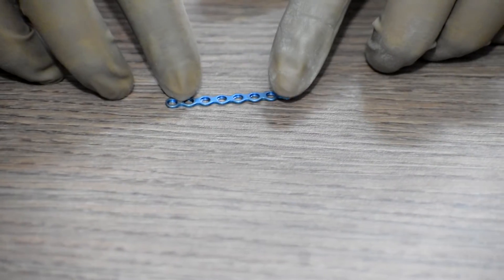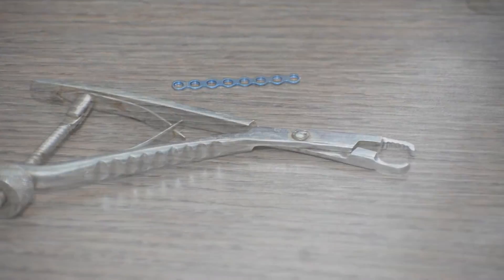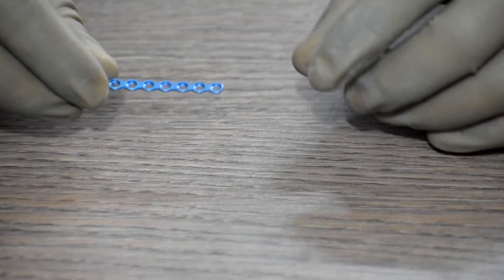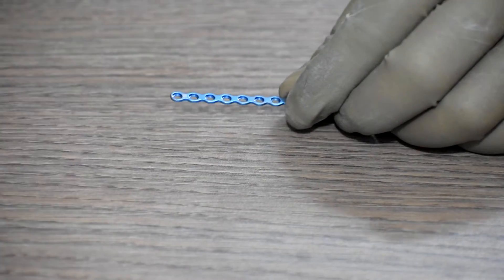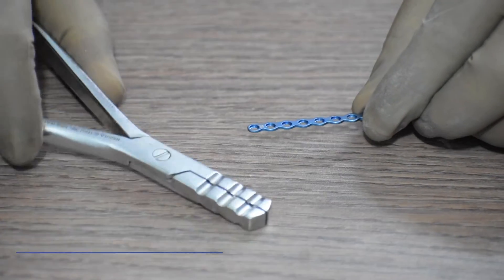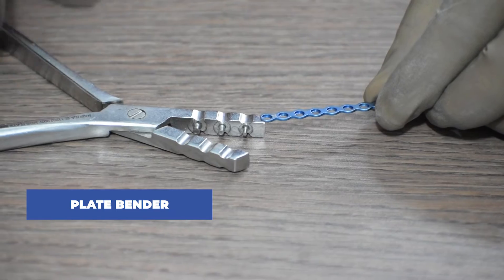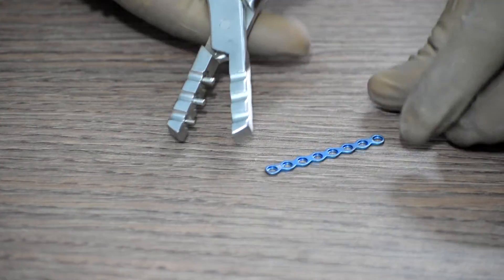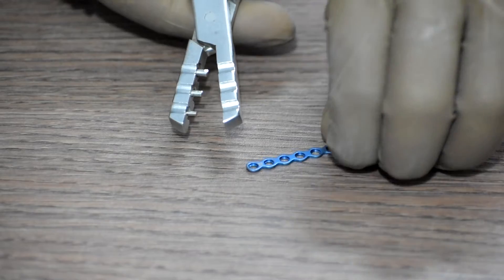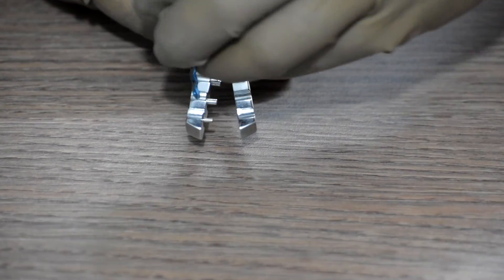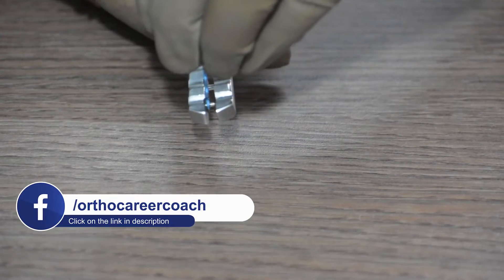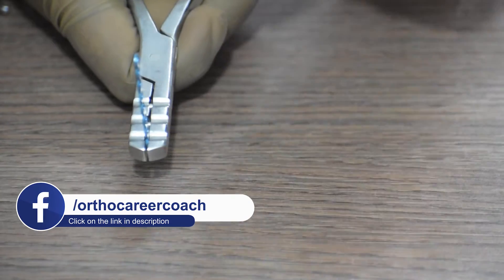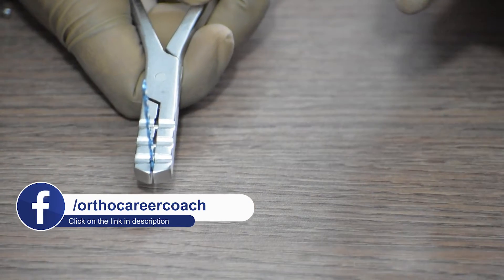First, we will have to hold the mini straight plate in the fracture site using plate holding forceps. If we find the plate is not properly aligned with the bone and the fracture, we use a plate bender to bend the plate to have proper alignment. We fix the plate in these bars and then apply pressure to bend the plate.